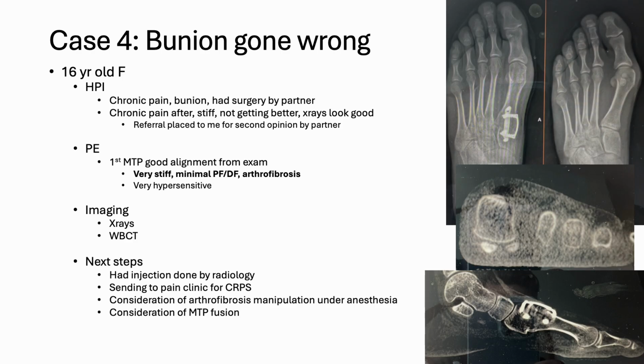There is a good study showing that sesamoid axial views also help as well. So if you can't get a weight-bearing CT scan, maybe you need to get a sesamoid axial view for all your bunions. I'm just adamant about getting weight-bearing CT scans because I can get so much more information. But this highlights that a lot, I think.